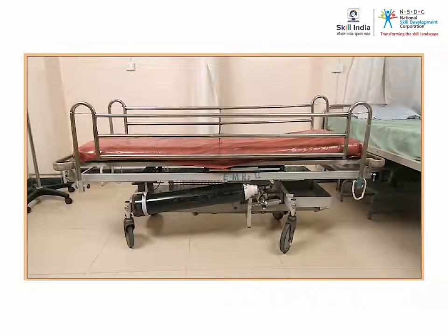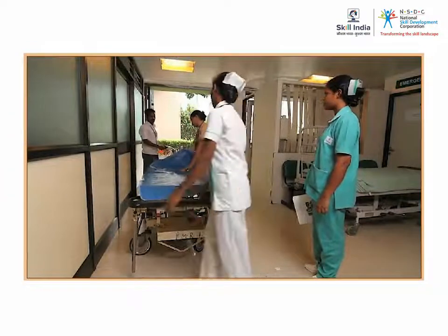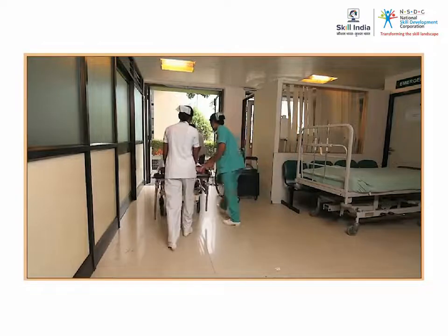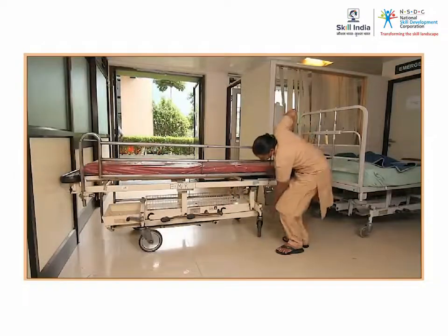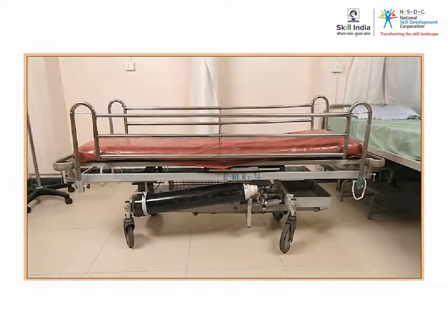The stretcher is a critical component of the hospital system. It serves as a hospital bed that can be moved from one ward to another. You must understand the different parts of the stretcher before you start using it. The stretcher is designed with the following parts.